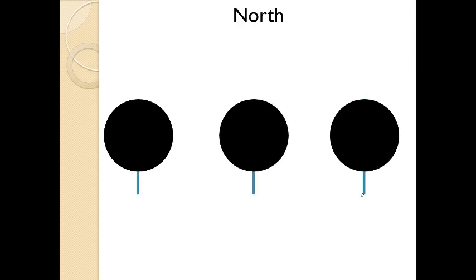Okay. So if we're sitting here looking at this, right, what we should see is that if this compass, for example, contains air, as soon as I lift my finger, it should go right back to north very, very quickly. If this compass contains water, it'll be a little slower. And the amount of time it takes the air compass to go north, it might only go halfway. In the thick syrup, it might only move a little bit, right? And we can actually take an image at any point in time and see where the needle is. And that'll actually tell us the thickness, the viscosity of the liquid inside the compass.